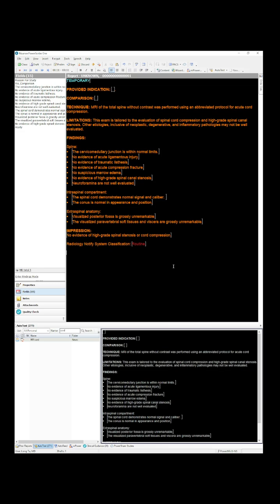I think it's a big deal, and for people who are nearing the end of training, or who may work in an area where spinal or total spine reporting is going to be part of their practice, I would have you consider whether any of these tools and strategies will be useful to you.